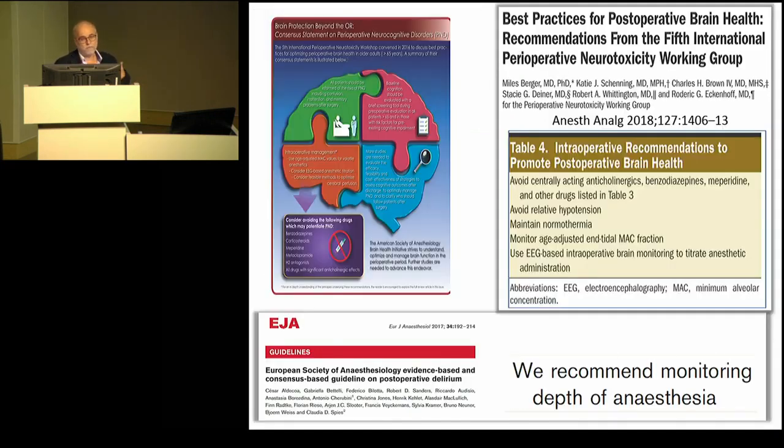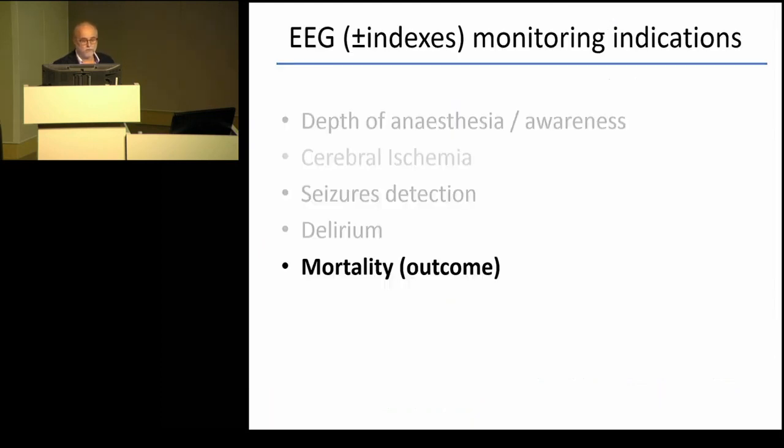Due to this, many institutions, many societies recommend that we monitor the EEG, monitor the indexes, whichever machine you are using, to reduce the chance of the patient having delirium in the postoperative period, especially those patients with high risk, as we saw at the beginning. Older patients with high risk of getting into deep anesthesia should be mandatorily monitored to reduce the potential for delirium.